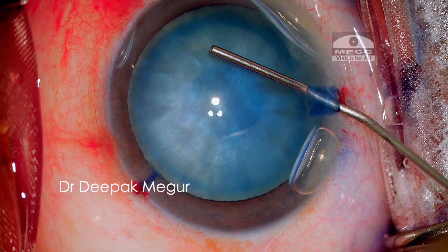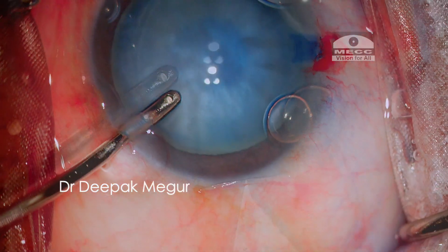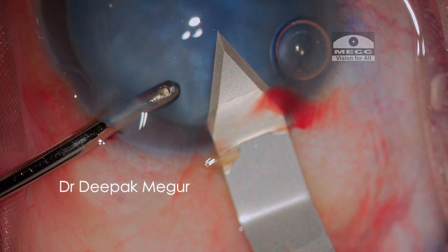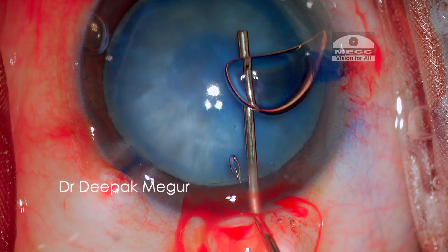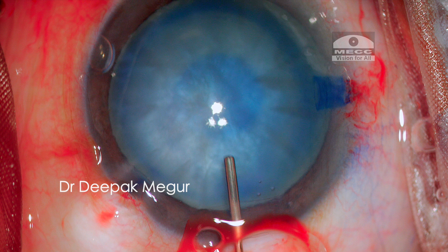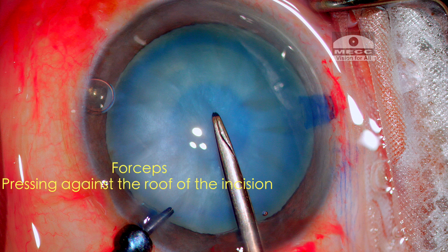After staining the anterior capsule, I stabilize the globe with an aspiration cannula and make my posterior limbal 2.8mm incision. I'm using sodium hyaluronate 1.4%. The best instrument in this case would be a micro forceps to ensure minimal loss of the anterior chamber when used at the side port. However, I'm using Dr. Haldipurkar's capsule rhexis forceps at the main incision. An important point to note is that the elbow of the forceps is always lifted up and pressing against the roof of the incision so that the OVD does not escape.